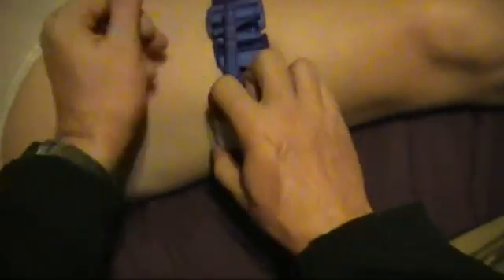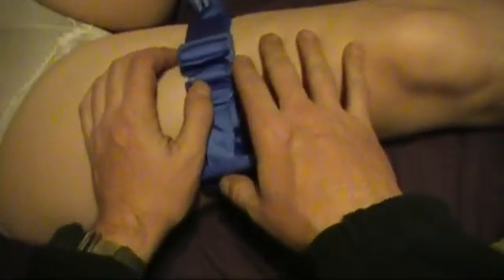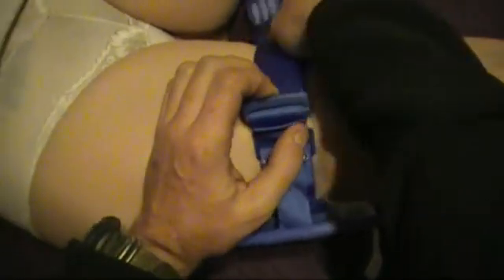Now, that's with the CAT tourniquet. The other thing is improvised tourniquets, okay? Now, it's kind of messed up, but a lot of you never went through Cub Scouts or Boy Scouts or any of that first aid stuff for wilderness medicine. So you have absolutely no clue that you do not need a nifty CAT tourniquet in order to create one.